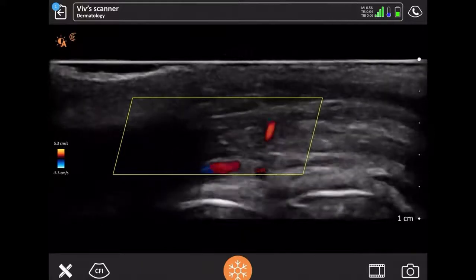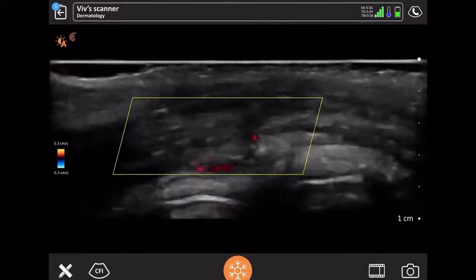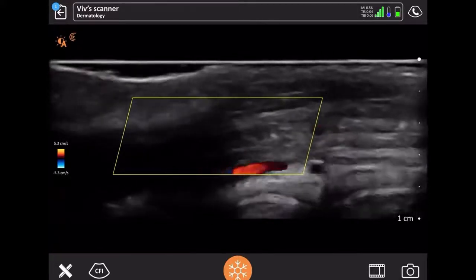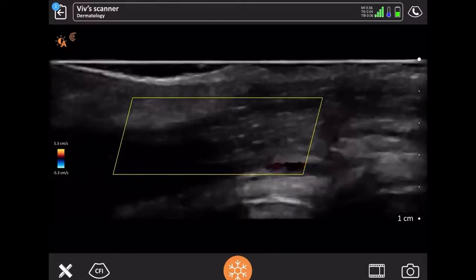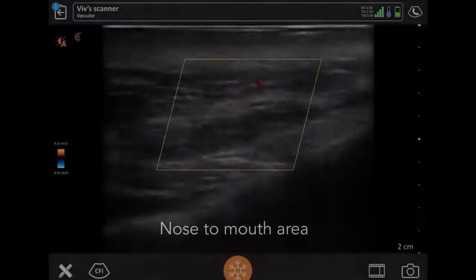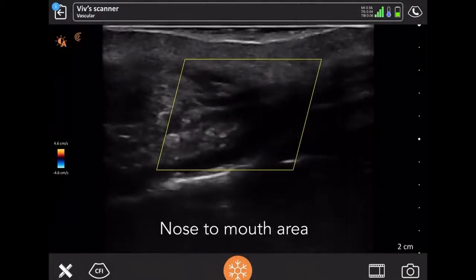But this blood flow varies in different patients, and the problem is the blood flow isn't the same for everyone. One of the benefits of using the scanner is to show the differences between one patient and another. So here I'm just moving the Doppler box to another area.